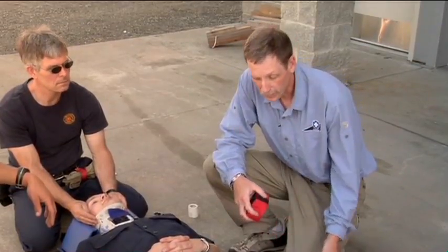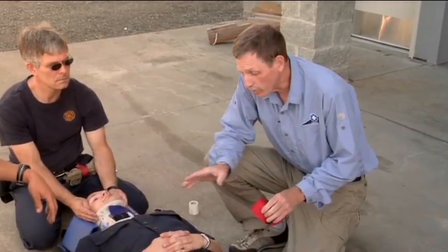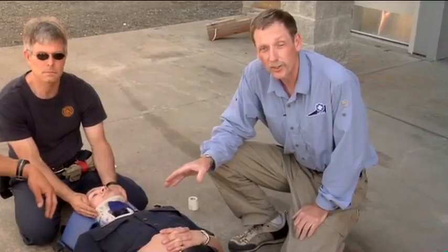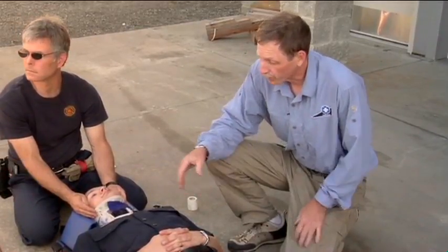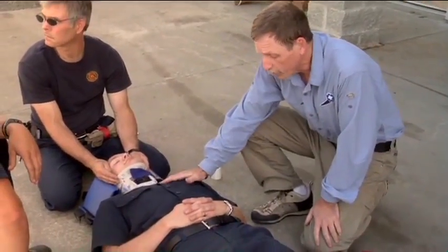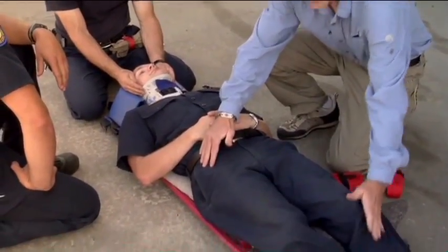piece of equipment. The way we're going to use these is we're going to use the weight centers of the body and the anatomical structures underneath those weight centers, and that's going to dictate how we use the strap. The weight centers of the body that we're concerned with are the upper chest, the pelvis, and the lower legs.